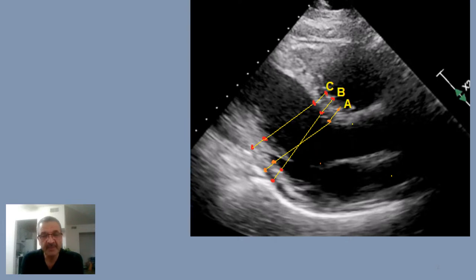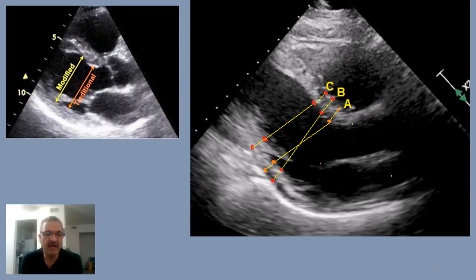Look at this end-diastolic PLAX view picture — three techs did three different measurements. Which of them is correct? Or when we have a sigmoid, prominent sigmoid septum, which spot is best for measurement and most accurate?